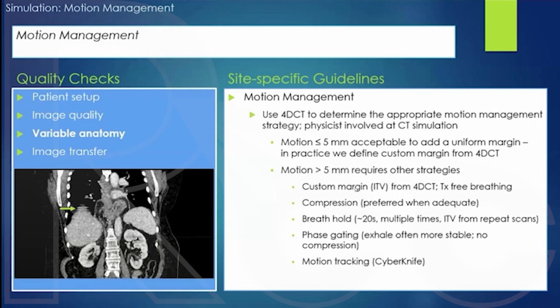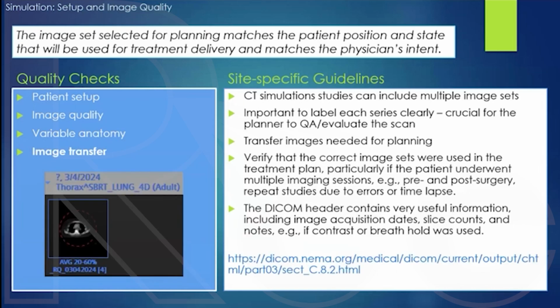Okay, so there's a second question about when to use the deformable registration. The answer is, for our institution, we actually use it anytime we need, but the key is really how you take the registration result. Is that a reasonable deformation or not? So there is no specific case where we use deform or not, but we do very careful QA when we review the registration result. We look at the deformation map to think about whether those deformations are reasonable for the patient. If they are reasonable, then you could use that registration to help guide the contour.